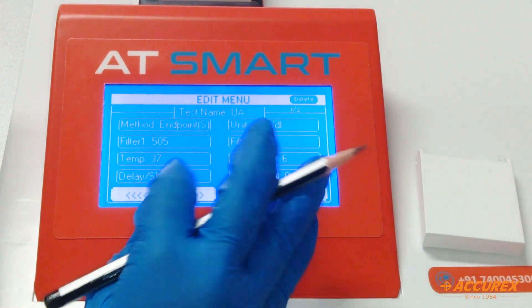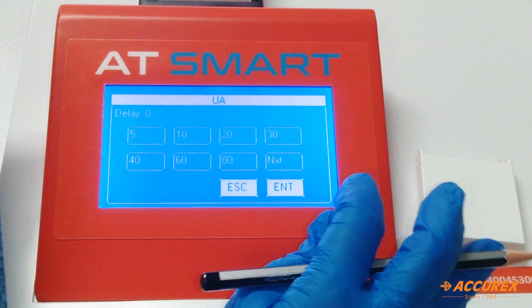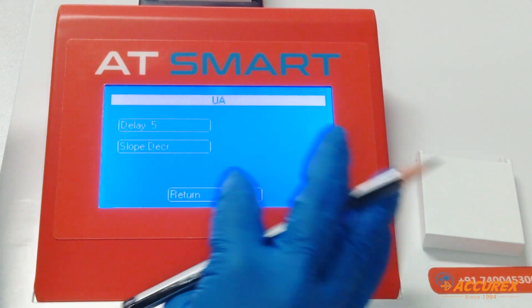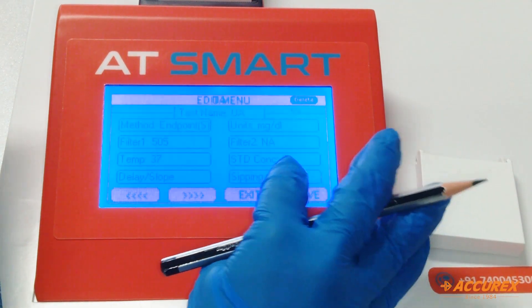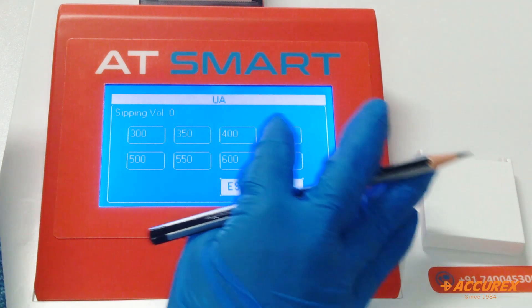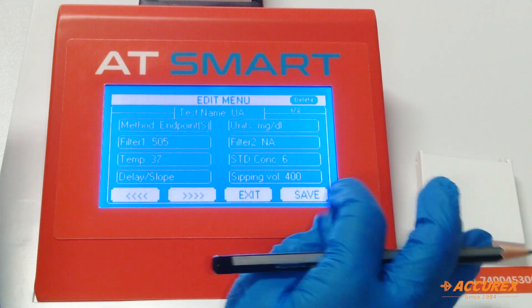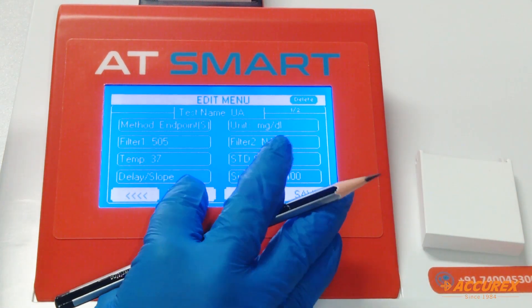Delay time: because it is an endpoint reaction, the delay point is up to 5 seconds, so select 5 and save. Sipping volume is 400. Now we will go to the next page.